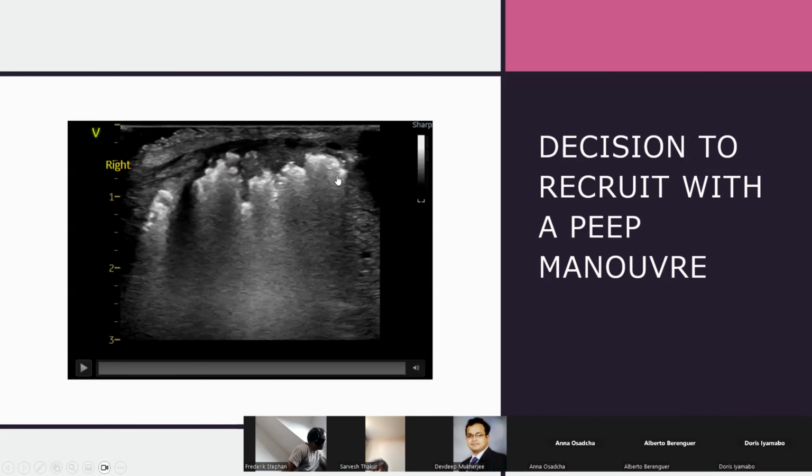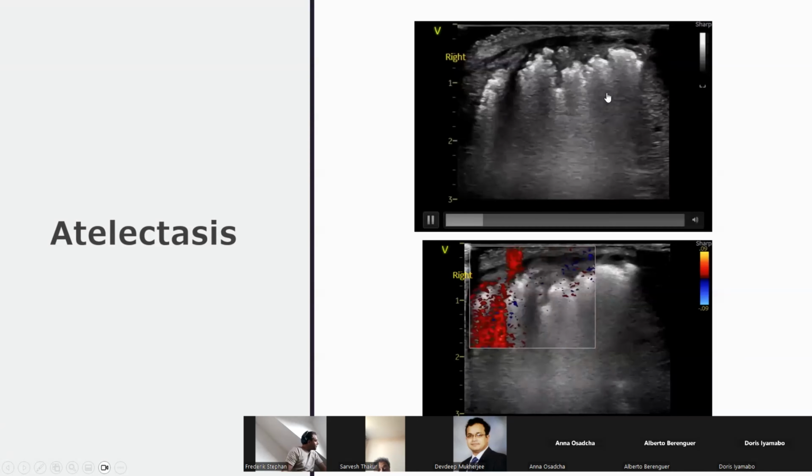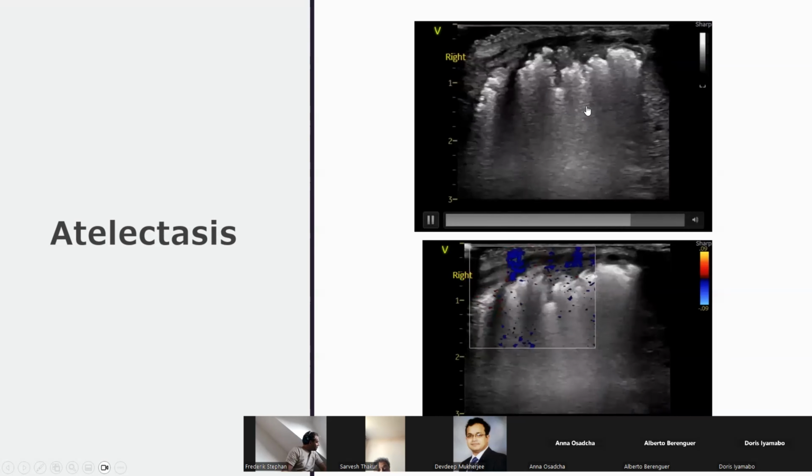And we actually did go up on the PEEP a little bit more in this situation, but didn't have any further improvements. So then came back down. And we kind of kept our PEEP at about 7 in this baby, 7.5, as opposed to, I feel a little bit nervous using PEEPs above 8. I know that people use them 12 to 14 in some cases for acute recruitment maneuvers, and we'll talk about the danger of doing that.